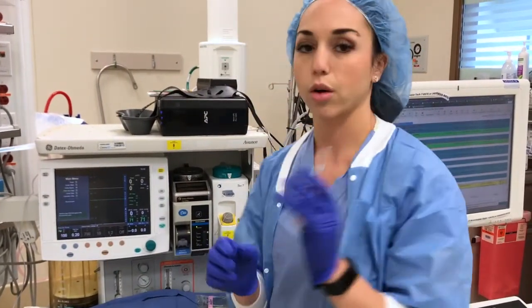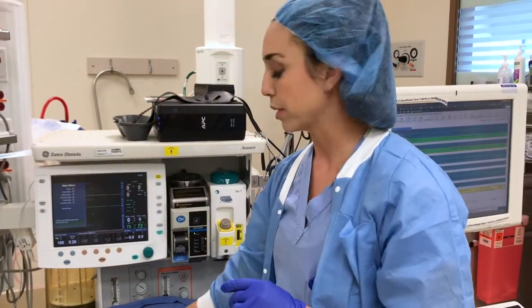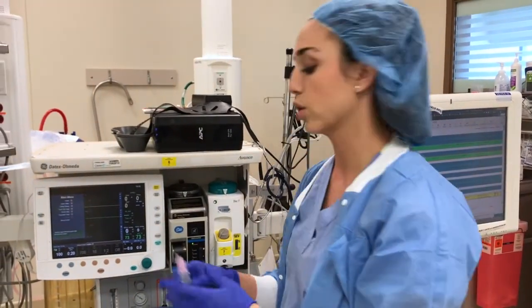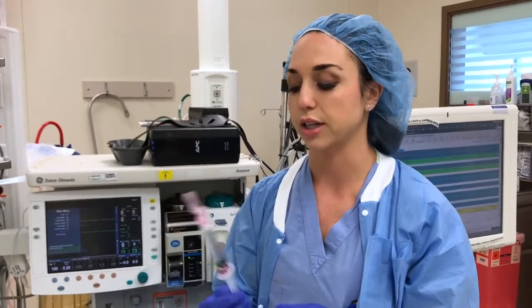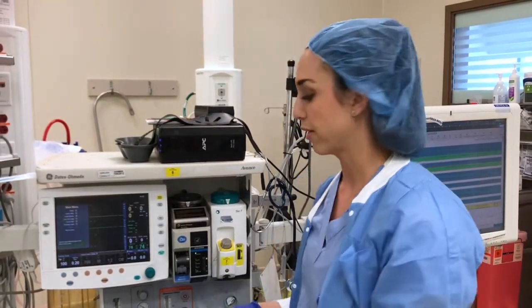And then I also take out Versed and fentanyl. These would be, again, for your non-pregnant patients to help them with the spinal anesthesia. And then, of course, having a vasopressor or a vasoactive medication available. Most commonly, it'll be your Neo-Synephrine or phenylephrine bag, but you may also have some ephedrine available if you need to.